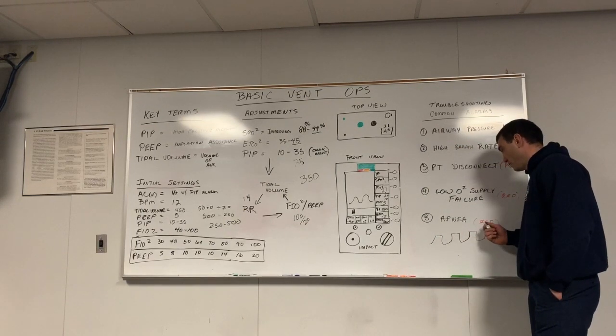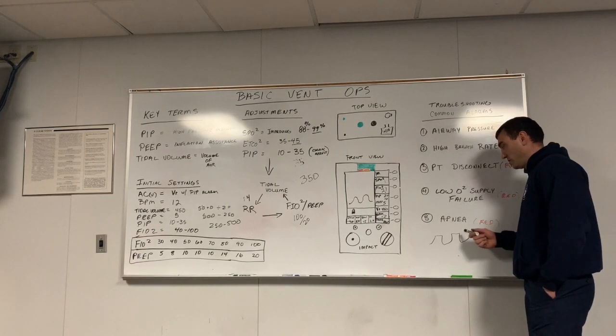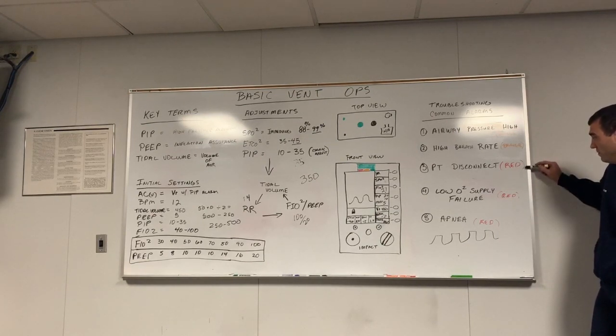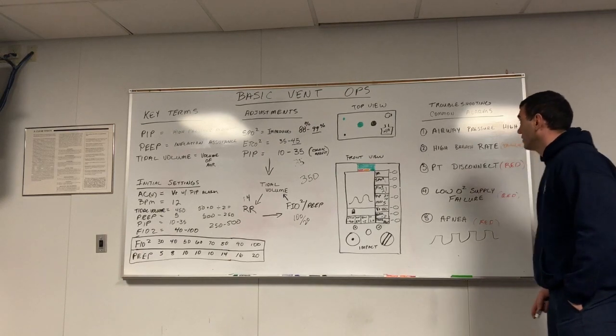This is a red alarm. The ventilator will stop if you continue with this alarm. It has to be fixed. Same with O2 supply, same with patient disconnect. The ventilator will not work with red alarms. If you have a red alarm, you have to fix it.